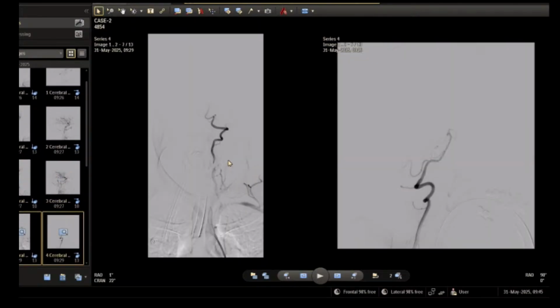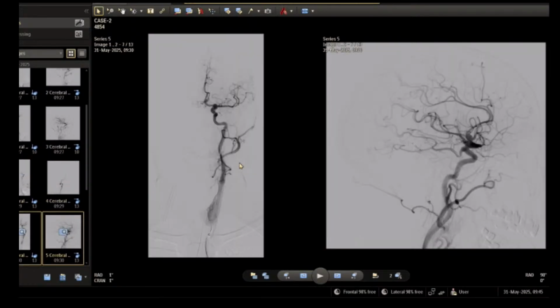And this is a Presidential Hospital Almaty, National Hospital in Almaty. And the vertebral system is clear.